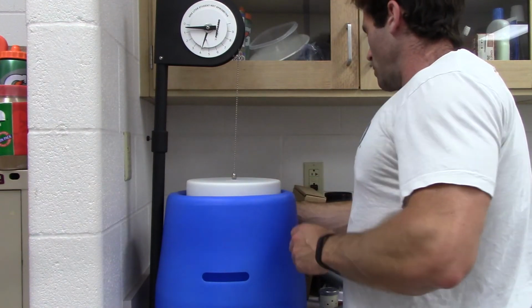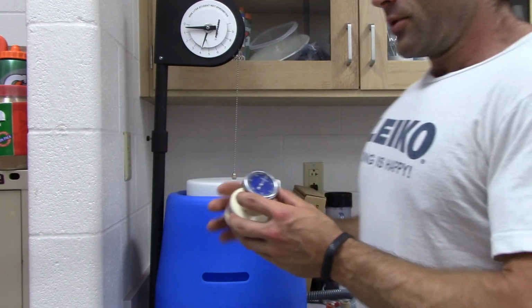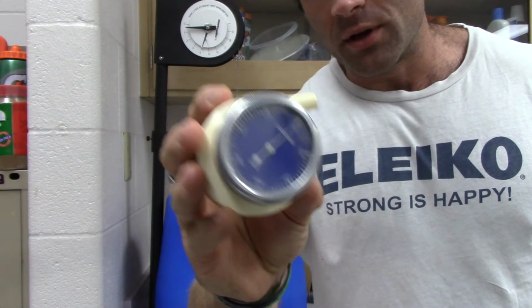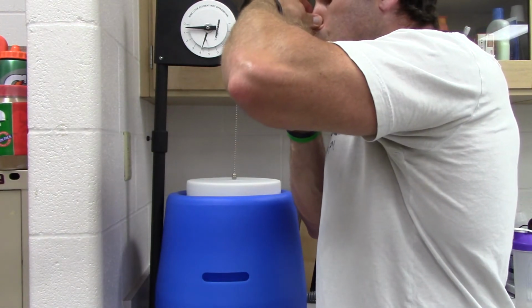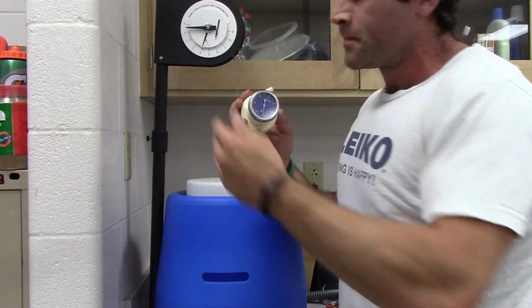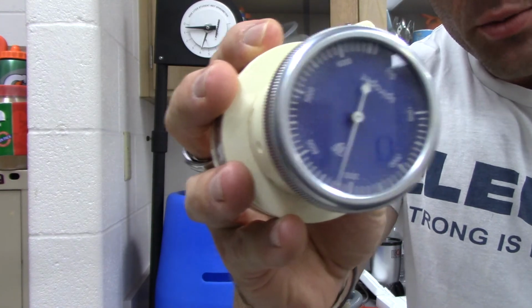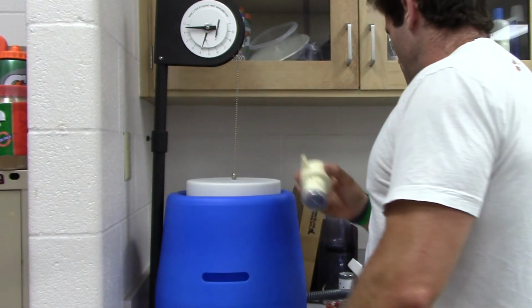Now, we have a couple of other interesting old school machines that I found when I was cleaning the lab. An old school spirometer that's based upon your ability to keep blowing into it to get the air out. So you're going to take a deep breath in. And then it's going to move forward to figure out what the volume is for that given breath. Now, I don't know if I put that much stock in it, but that is what it came up with.